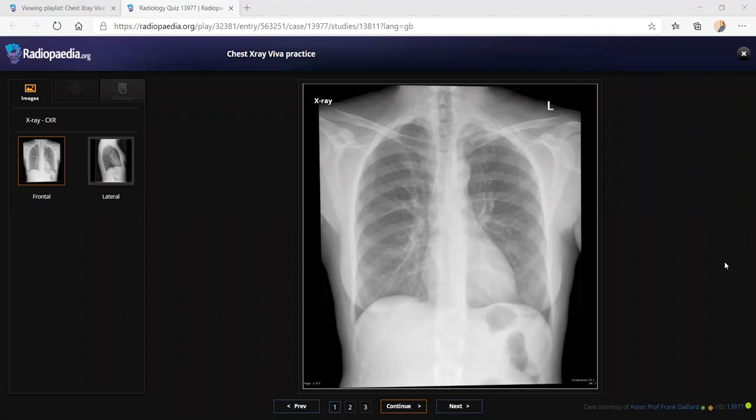I have suspicion of an ill-defined nodule in the left lung lower zone, near the left pericardiac border. Here? Yes. That is a nipple shadow. Okay. When I'm looking at the retrocardiac shadow, the left retrocardiac shadow appears a bit denser than the right retrocardiac shadow. This one? Yes. That is because of the breast. Okay.